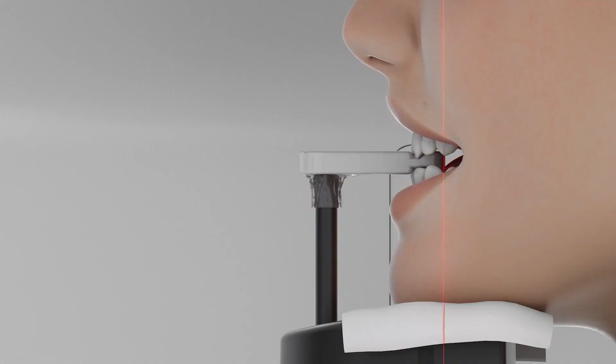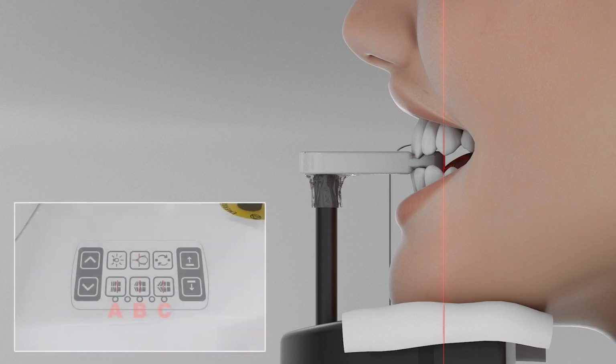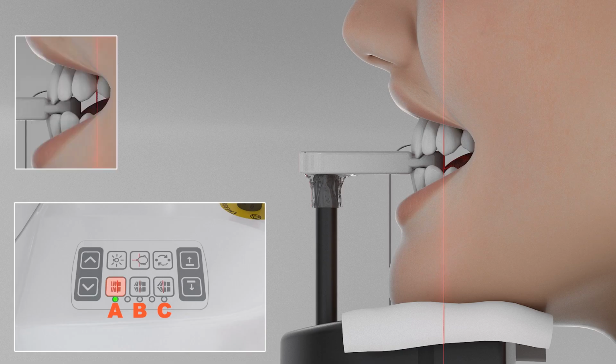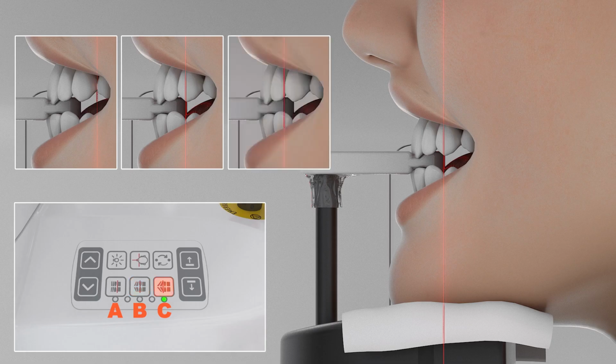Check the image layer laser position. Ideally, this line should fall on the middle of the maxillary canine or base of the nose if edentulous. However, given each patient's unique anatomy, the line may display anterior or posterior to the canine. Select the button that corresponds to the position of the laser light relative to the patient's canine. Choose A if the laser line is posterior to the canine on the patient, B if it is on the canine, and C if it is anterior to the canine. The laser light itself will not move, although the unit has been internally adjusted to acquire an optimal image.